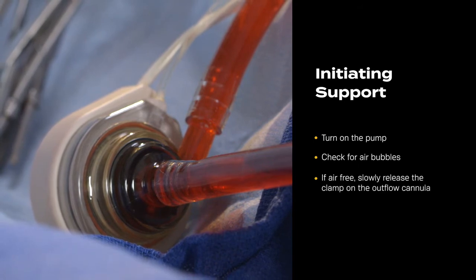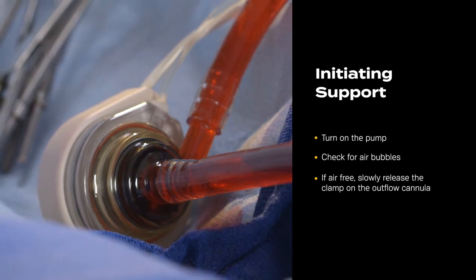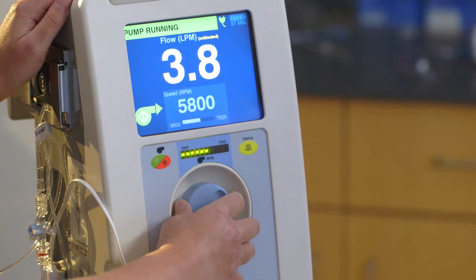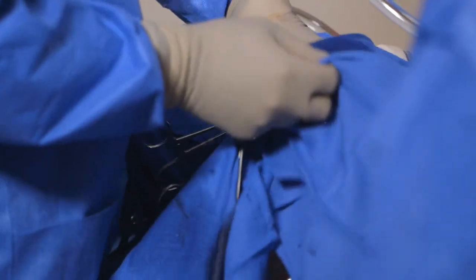If the tubing and pump are air-free, slowly release the clamp on the outflow cannula. Gradually increase the speed of the pump until the desired level of flow is achieved. When appropriate, remove the sterile drapes from the cannula insertion sites.